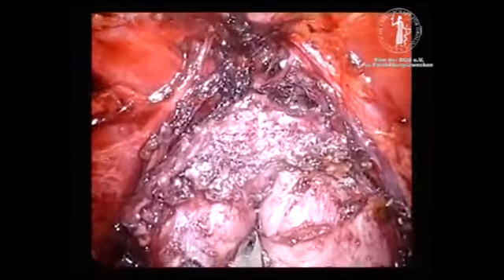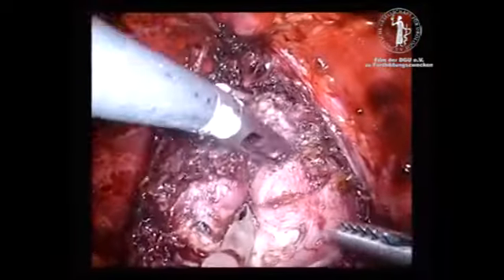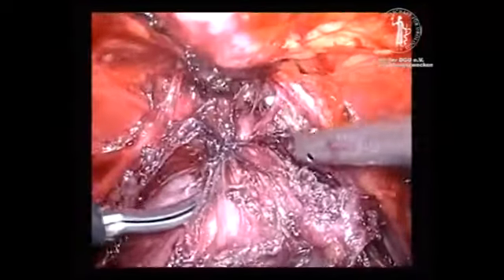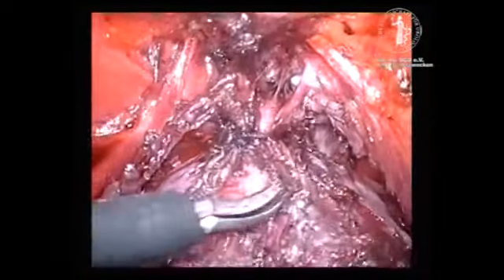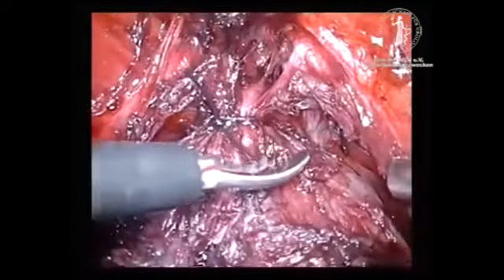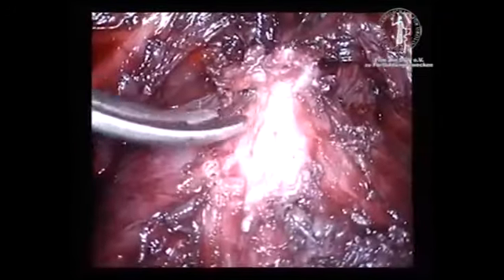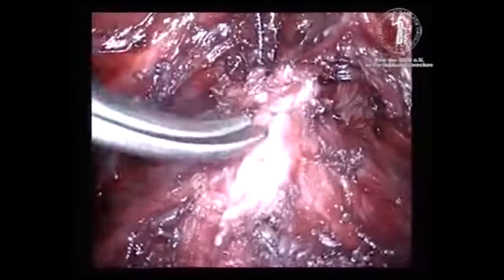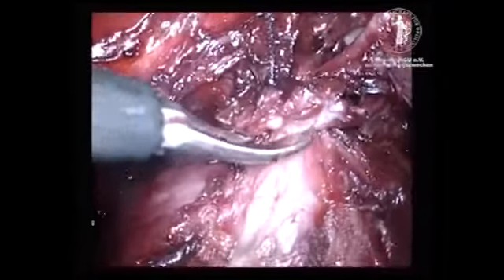According to the anatomy of the urethra, the final apical dissection is a three-step procedure. The first step is the dissection of the dorsal venous complex and overlying connective tissue. This is performed from laterally to medially until full dissection is completed. For optimal access, the prostate should be pushed dorsocranially.